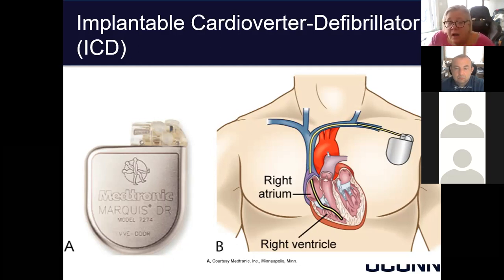But it's still uncomfortable. Patients need to know, number one, they have a defibrillator in. They should know, maintain their little card, which gives its settings, its brand, batteries and information and stuff like that. They need to call if it goes off. They need to call if it keeps going off. It may need to be tracked. But most of these, both pacemakers and internal defibrillators, have such long battery lives now, it's amazing.